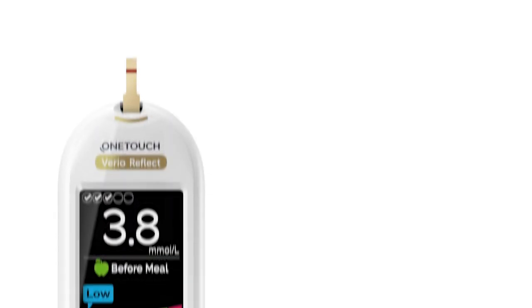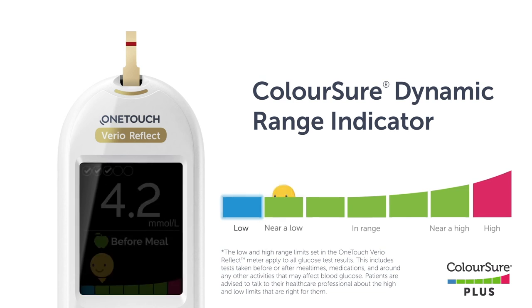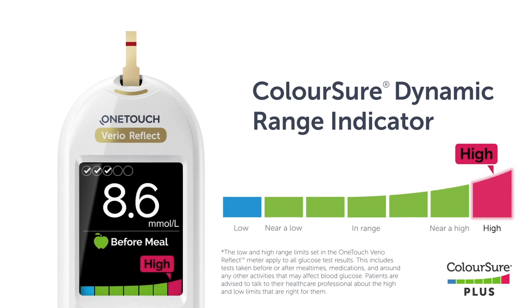The OneTouch VarioReflect Meter comes with a ColorSure Dynamic Range Indicator feature that instantly lets you know if your current result is below (blue), within (green), or above (red) your range limits. It also shows when your result is near the low or high end of your target range.